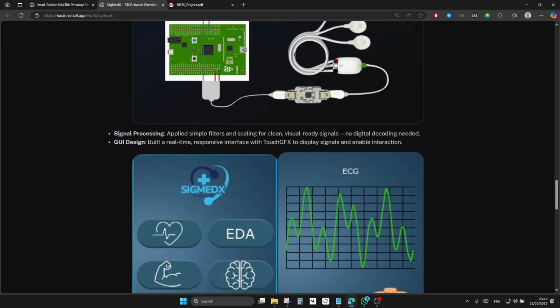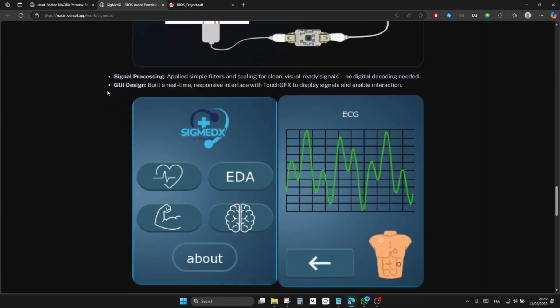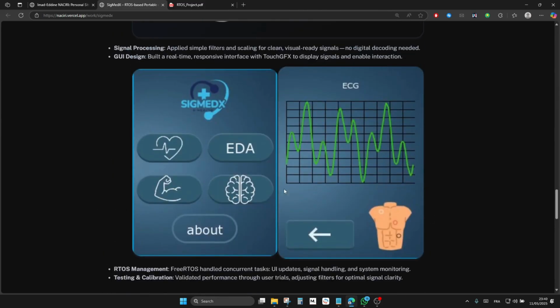Secondly, we have made the signal processing. We've applied filters for scanning and cleaning out data coming from the BITalino sensor. For the graphic user interface, we have built a real-time and responsive interface with TouchGFX to display signals and enable interactions. This is the application of the GUI that we have developed.